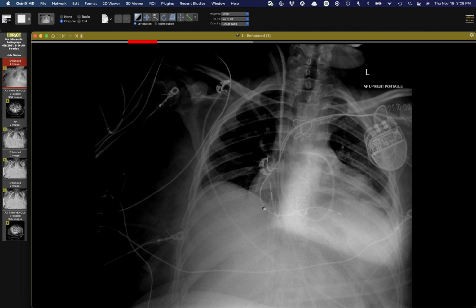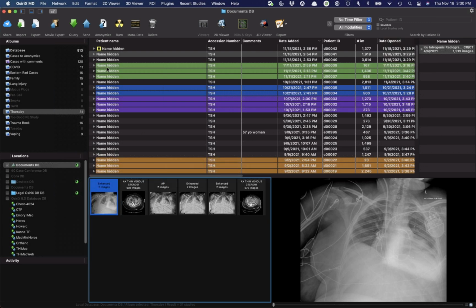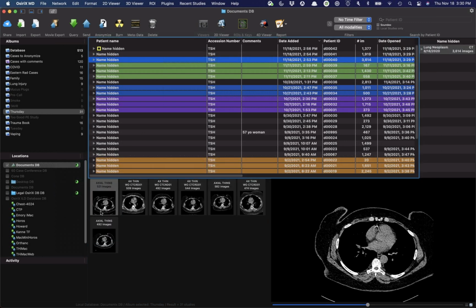And the one table I was looking at did describe the length of both the proximal and the distal metallic tips as well. I didn't notice a difference. Usually they're 5 or 6 millimeters. I'll have to look and see. That's an interesting point. I may be wrong about it, so let me know. Yeah, I'll look at the table again.